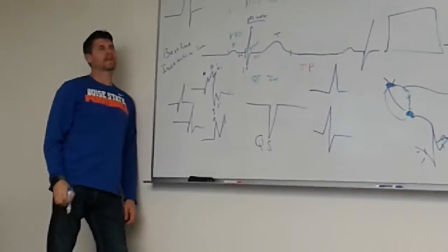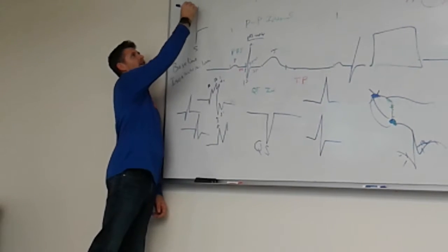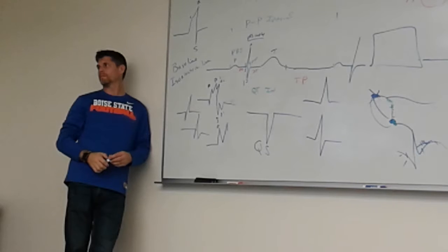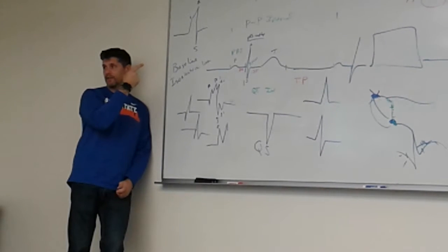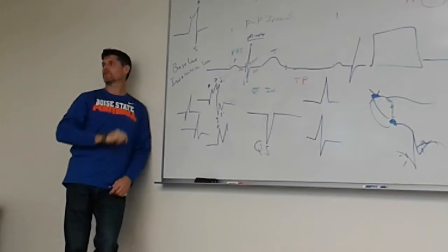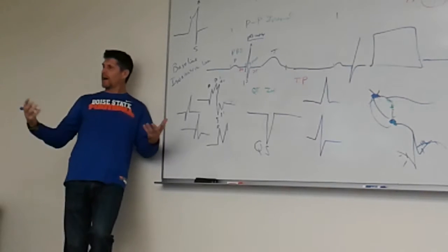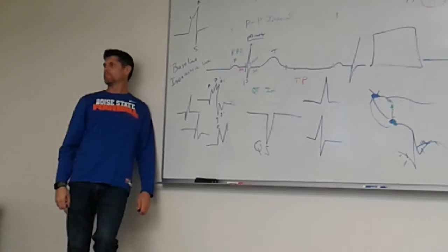Right? And this is an S wave. Is that R prime? This is an R prime wave. That's correct. Definitely an R. Do you call it an R prime S wave, or just R S? We still call this the QRS complex, but we would write it as an R prime S wave. That way, anybody who reads it would know exactly what we saw. But when we talk about it, we still say, hey, that QRS complex has an R prime.